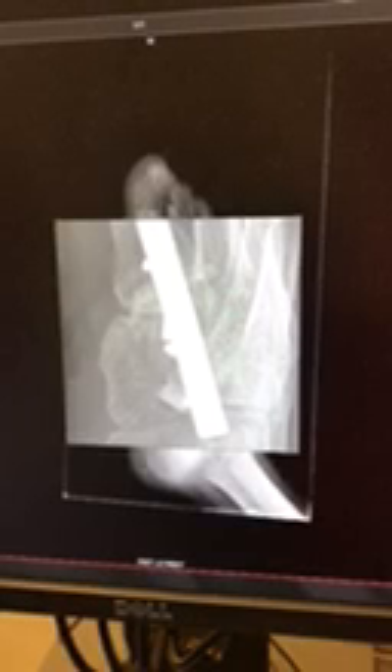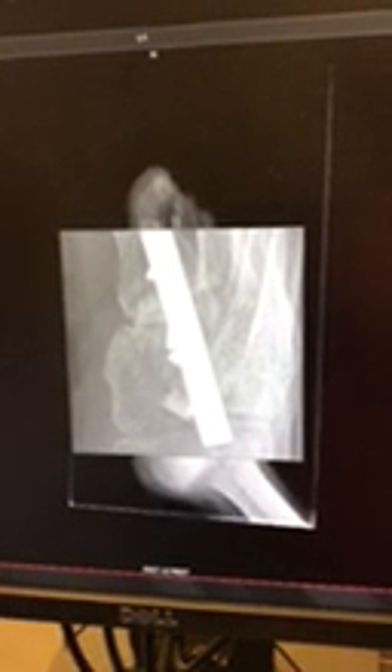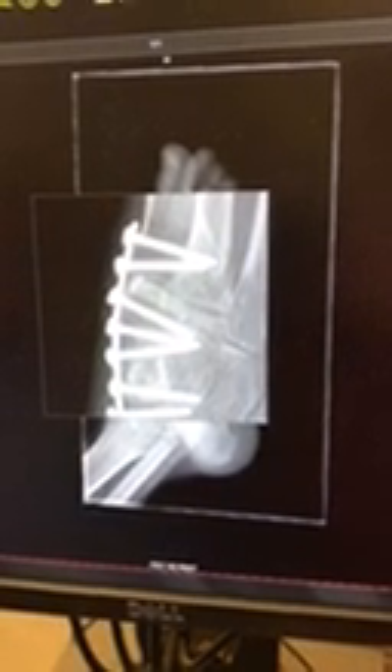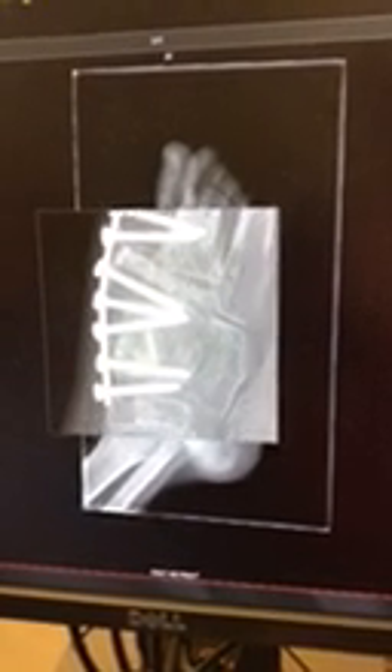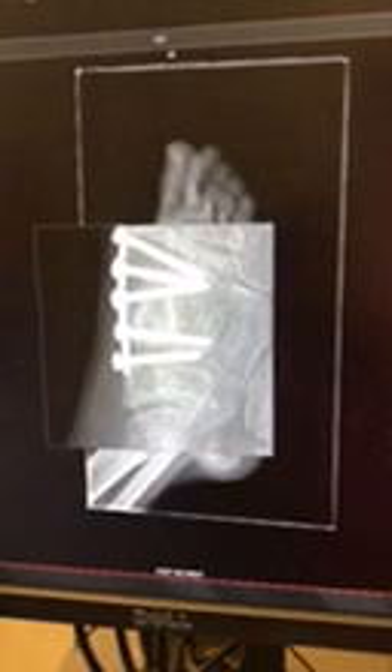Along the other views, you can still see some remnants of the bone grafts. This is about three months, I believe, but they're incorporating and the bone cells are migrating. They're not as white — total white is bad, we consider it mineralization of the bone, which is dead bone. And you can see incorporation of the bone, and beautiful contour and rigidity.